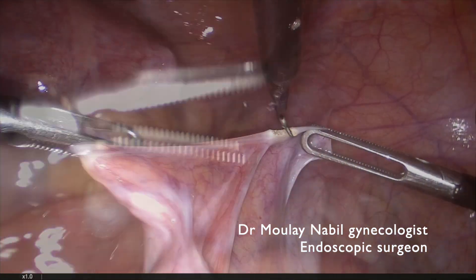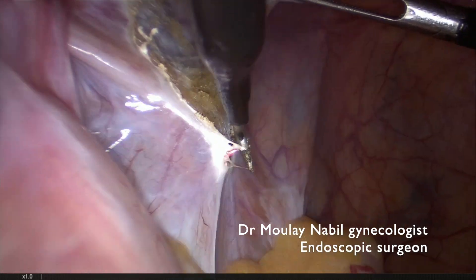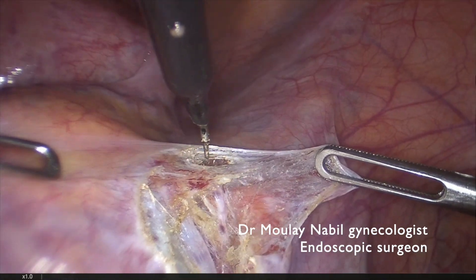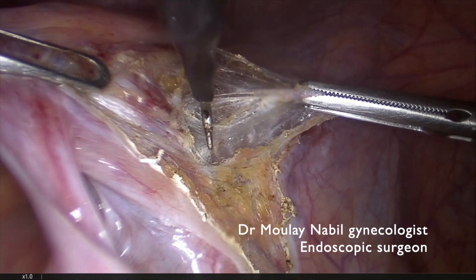This is a cervical isthmic myoma managed by laparoscopic approach. For that we have to control both internal iliac arteries at their origin to decrease the peroperative bleeding.